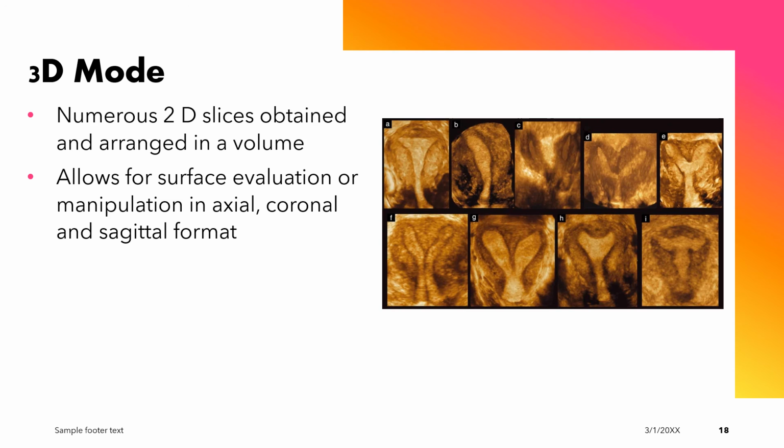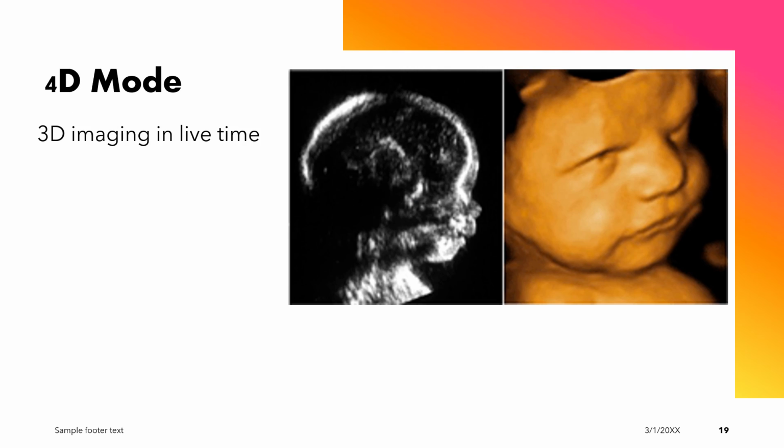Here is the T-shaped uterus that they see with DES exposure. This one has a little bit of an arcuate change, and this one is uterus didelphys, and this one's your bicornuate uterus. So you can see how, especially with uterine anomalies, 3D mode can be very, very useful. But again, it often takes quite a bit of manipulation after the acquisition of the volume.